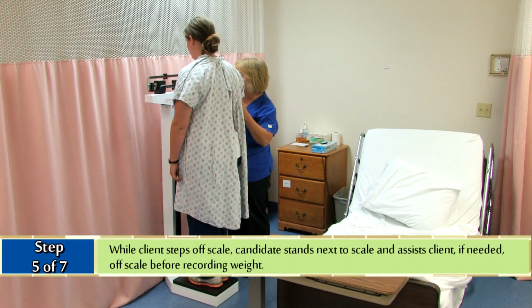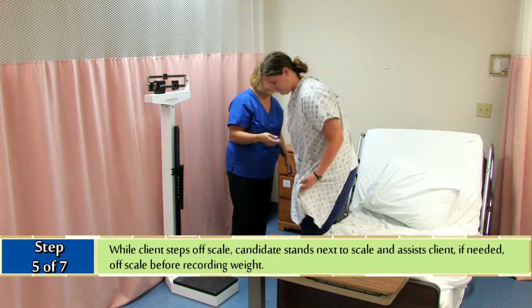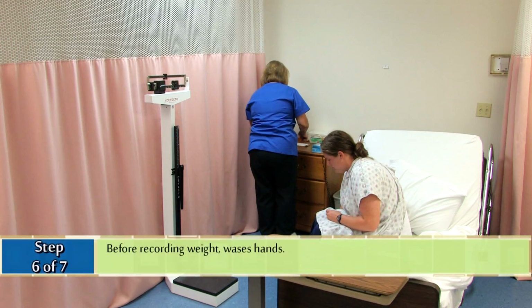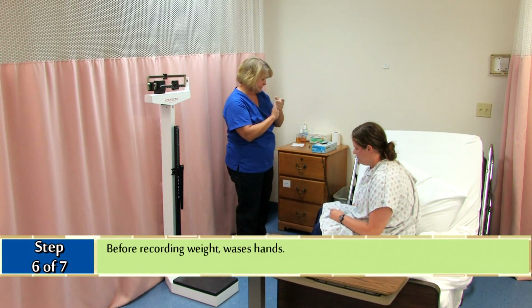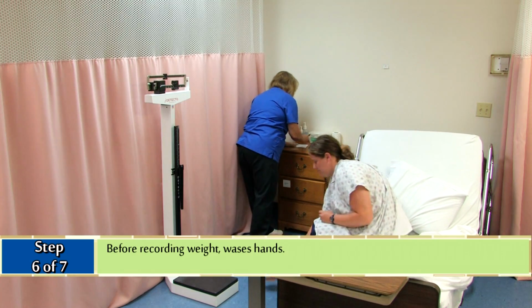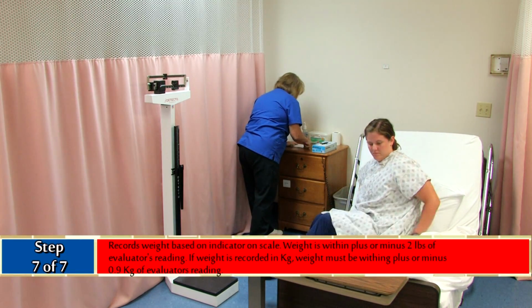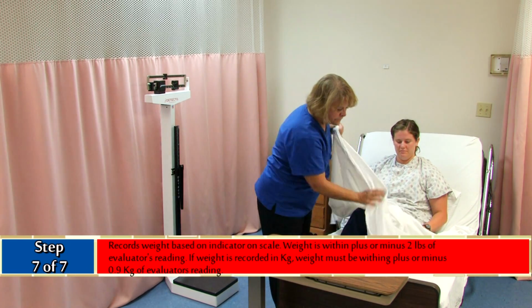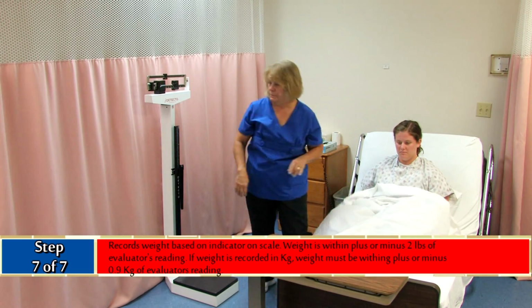Step 5. While client steps off of scale, candidate stands next to scale and assists client if needed off the scale before recording weight. Step 6 is no longer a critical element. Before recording, wash hands. Step 7 is the new critical element. Records weight based on indicator on scale. Weight is within plus or minus 2 pounds of the evaluator's reading.